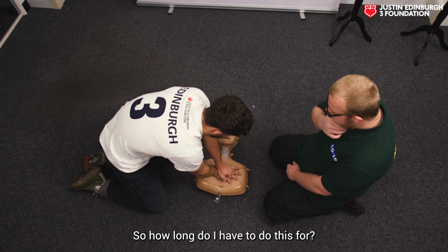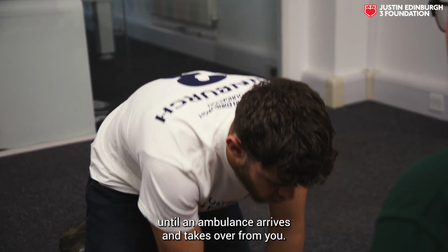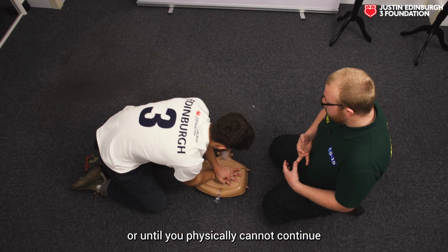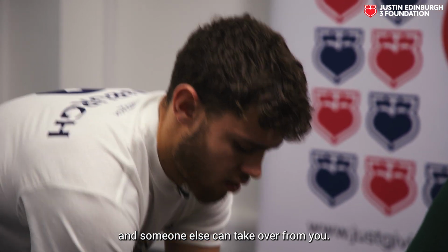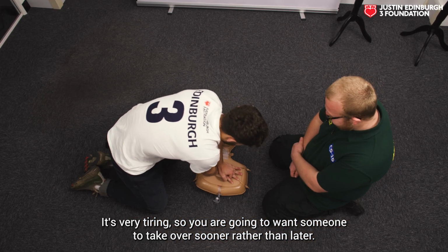So how long have I got to do this for? You're going to keep going until the patient shows signs of life, until an ambulance arrives and takes over from you. That doesn't mean when you see an ambulance, that means when you're physically told to stop, or until you physically cannot continue and someone else can take over from you. It's very tiring, so you are going to want someone to take over sooner rather than later.